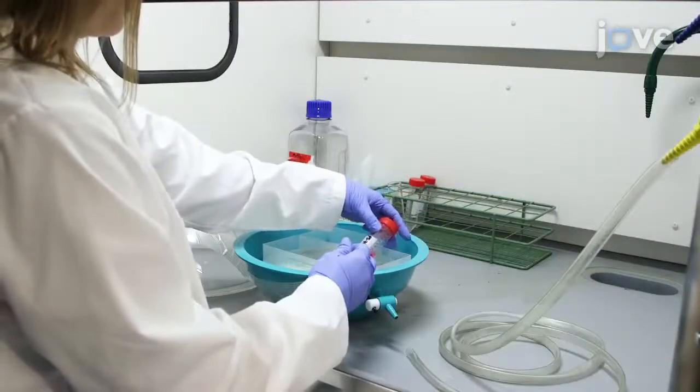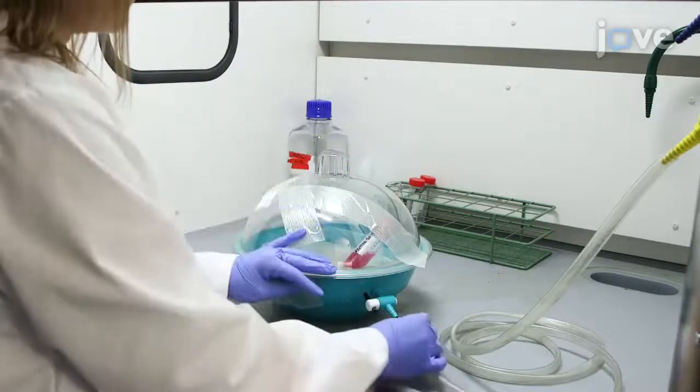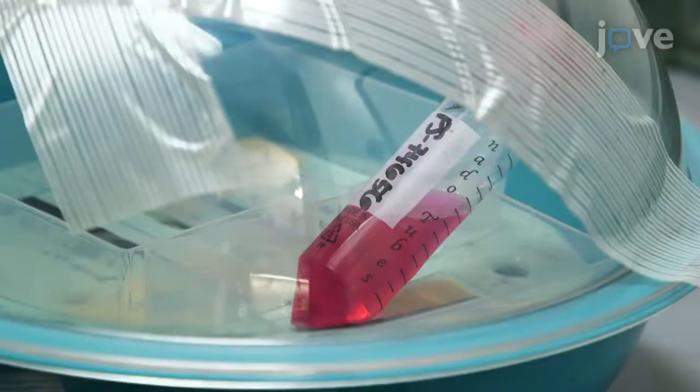Next, degas the medium by placing the tube in a vacuum bell jar at a 45-degree angle. Use a vacuum pump to apply a vacuum at room temperature. Maintain the vacuum for 24 to 48 hours until bubbles are no longer observed.